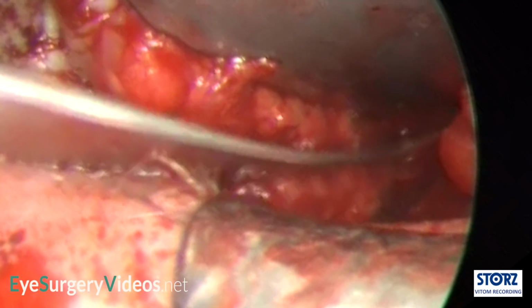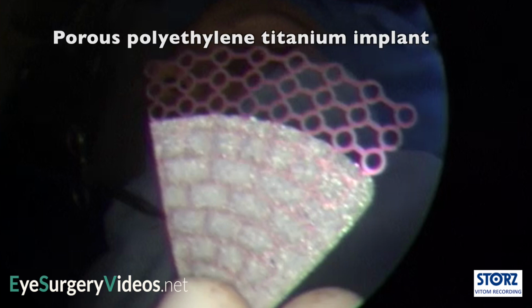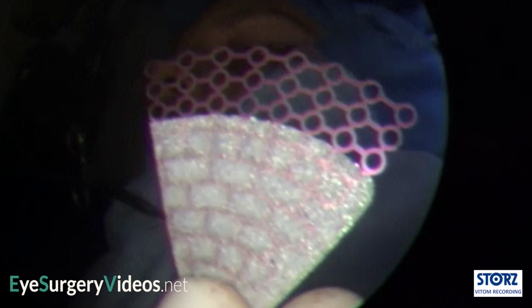If no posterior edge is present, the implant will need to be secured anteriorly with screws to provide a cantilever effect. Good hemostasis is very important, as compartment syndrome with subsequent visual loss is possible, although extremely rare. Hemostasis is achieved before continuing to prepare and place the implant. An orbital floor implant is often not required in a child when the floor returns to its normal position. However, in this young adult, an implant is being used in view of the residual defect and less elastic bone.